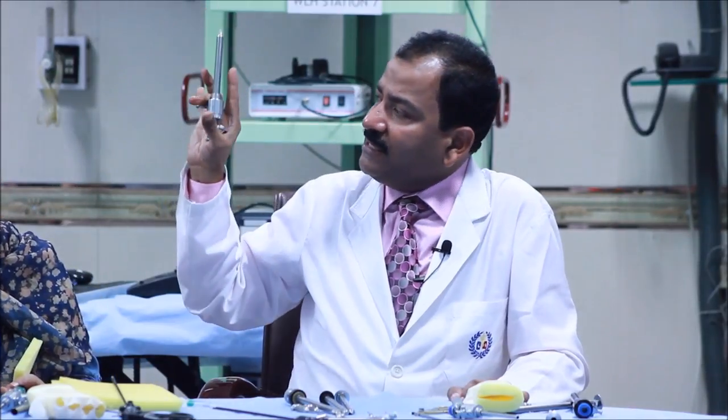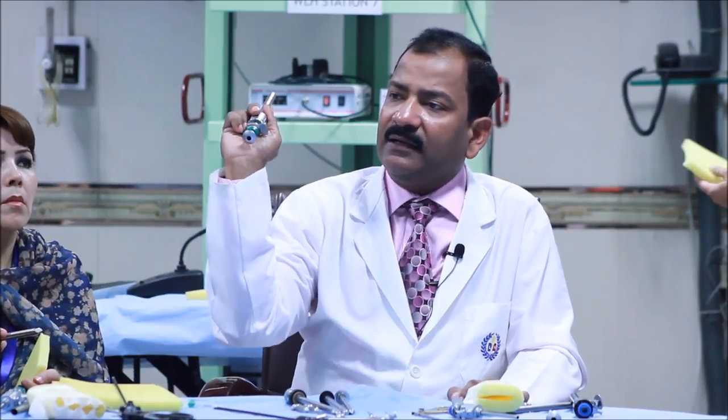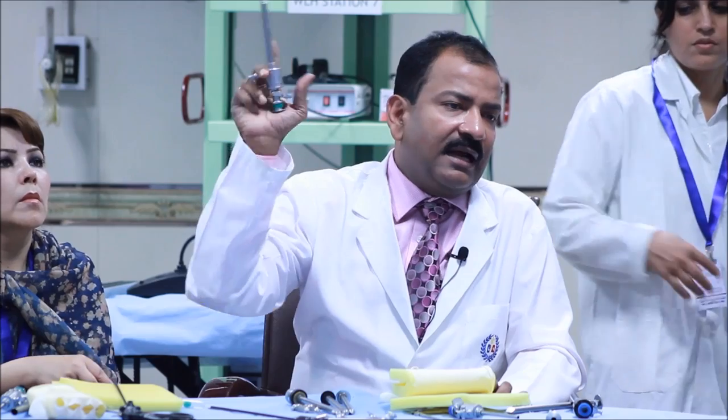This is the way how to hold the trocar so that the pressure over the thenar eminence and the middle finger counter each other. Do you know, if you do not keep it like that, then if you push it, the trocar comes back and you are struggling with the cannula, nothing happens. So, the thenar eminence and middle finger should press each other. This is important. And the index finger should be halfway reaching there.